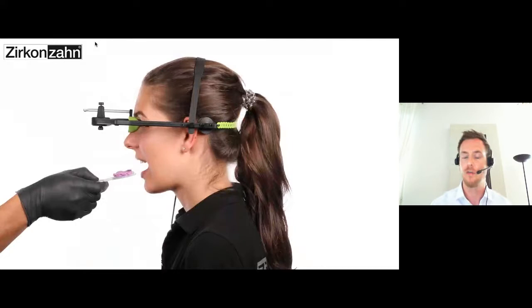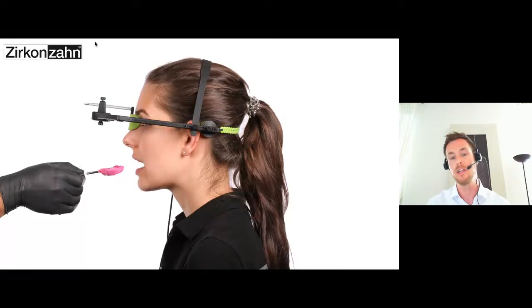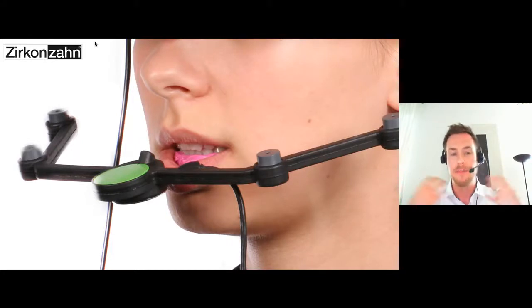So here again, a picture of how it's placed on the patient's head, and the workflow is as follows. We attach everything. Now we have a fork for the upper jaw to use in combination with the plane finder to register the whole patient in zero position, in natural head position, into that device. Then we register that, and then we change the fork for the lower jaw and fix it onto the vestibulum of the teeth. As you can see, in most cases we have a lot of space to the upper teeth, with no contact to the fork at all, to allow free movements.